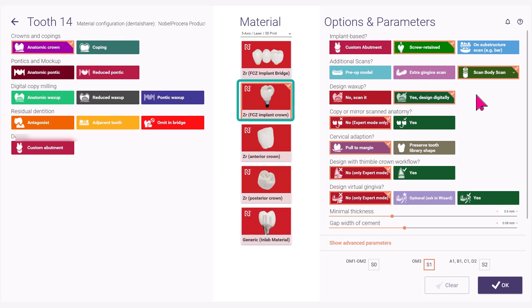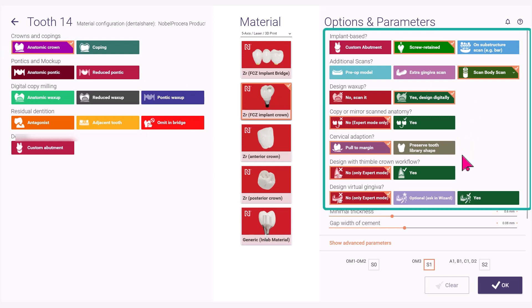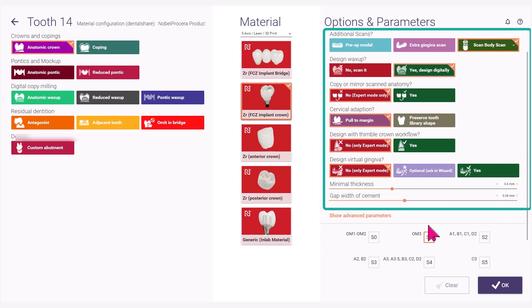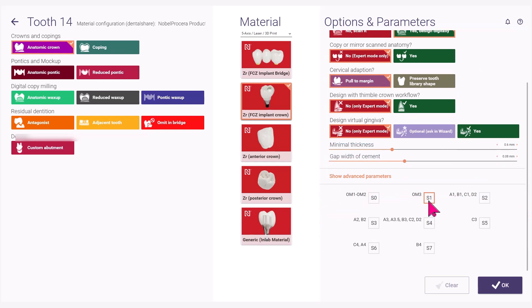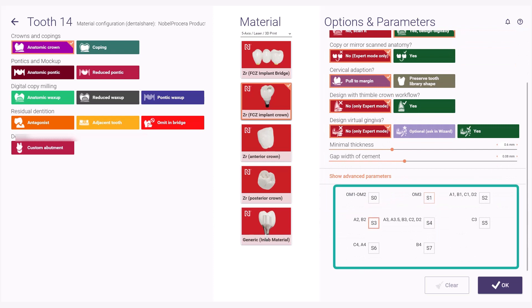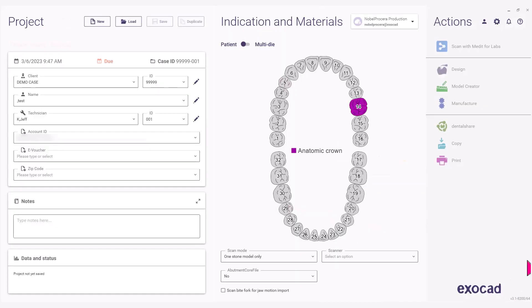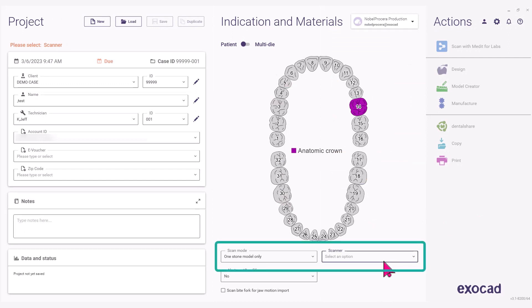Review the default options and parameters for the restoration. Scroll below under Shade and select the shade for the case and click OK. In the Indication and Materials section below, choose the desired scan mode and your scanner.